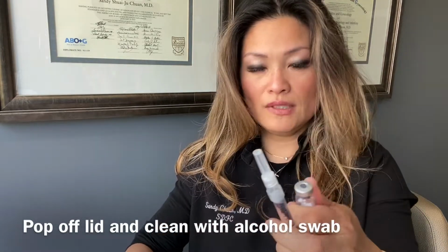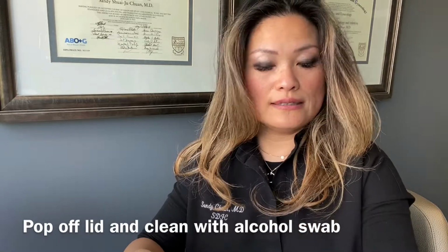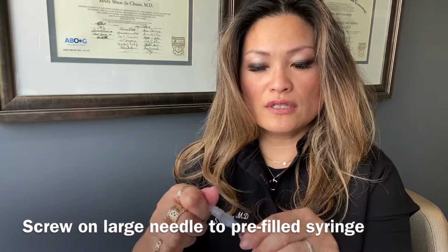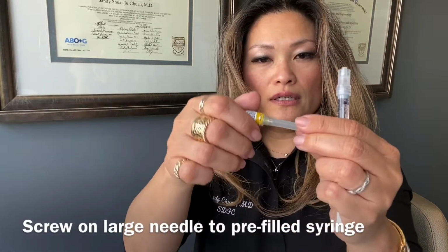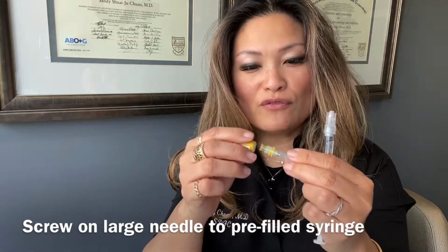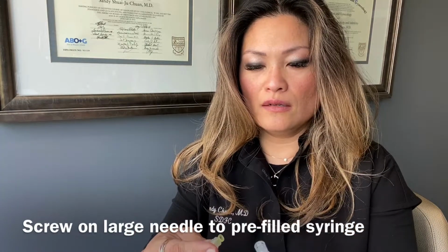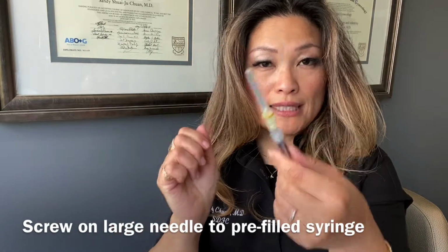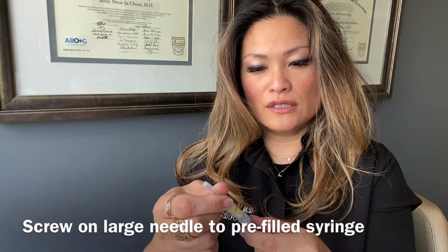first and then clean it, and then you want to set that down on your table, and then you want to prepare the syringe and the needle. So this just pops off like this, and then you want to uncap this. It comes off easily for me because the sticker has been broken before, but you may find that you have to twist kind of hard to get that first cap off because of the sticker. Again, screw that on really tightly to make sure that you don't accidentally lose the needle.